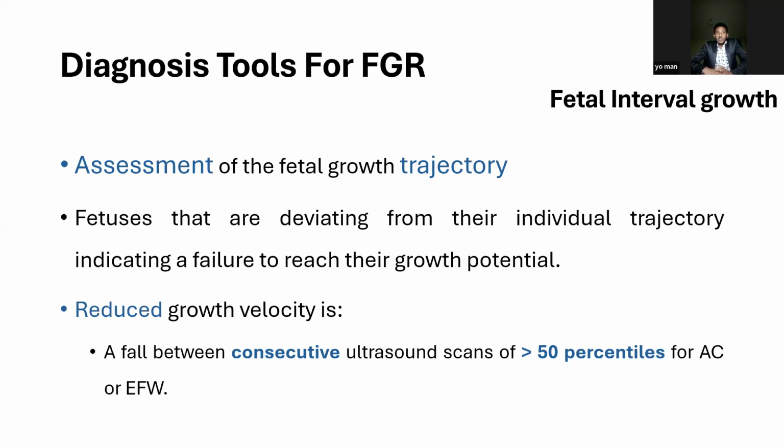So statistically, let's put that statistically. If you measure the fetal size and find it to be, let's say, the 80th percentile for the current gestational age, and after you scan the same fetus after 2 weeks or 1 month, you find that fetus to have a percentile of 20, there is a 60 percentile difference between the ultrasound that was done now and the one after some time.